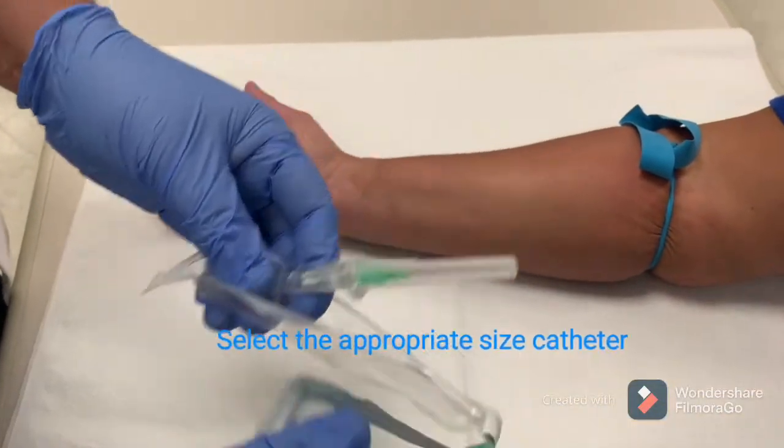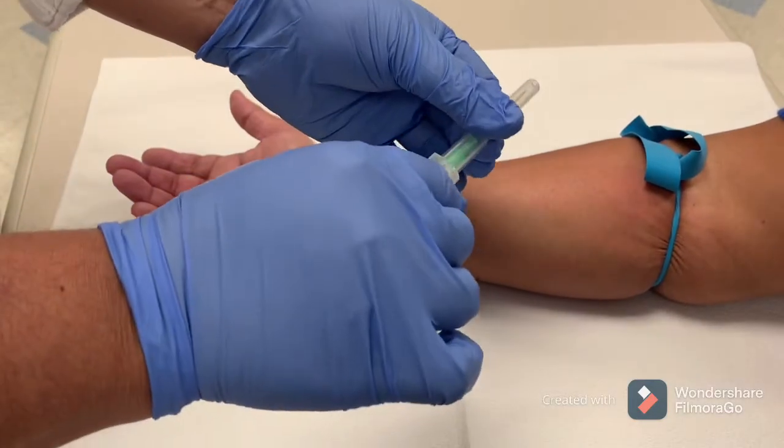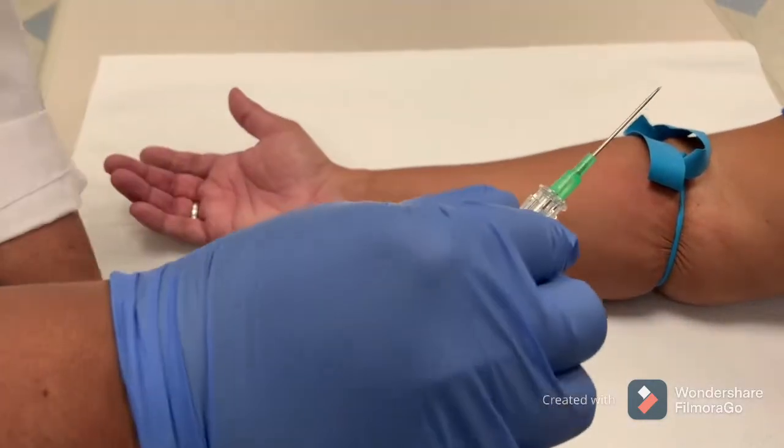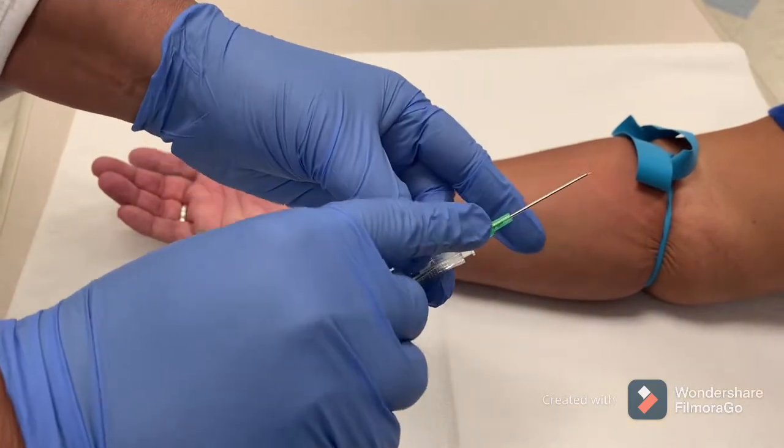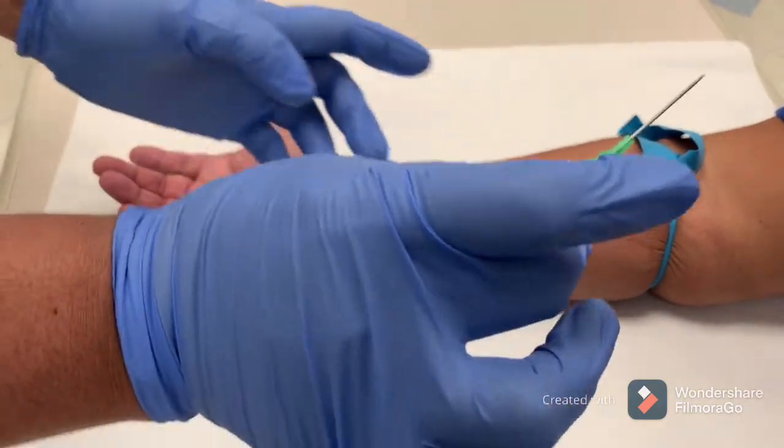Pick the correct sized catheter and select the vein by applying the tourniquet. Select a visible, palpable vein for the insertion of the catheter.